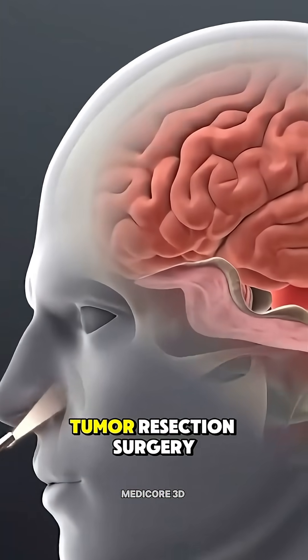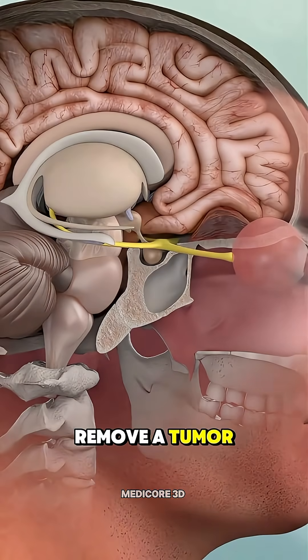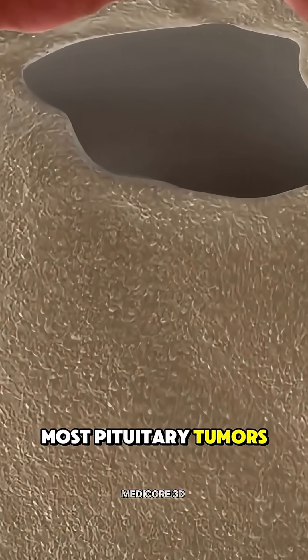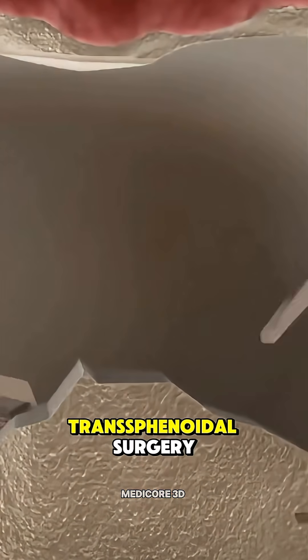Let's talk about how pituitary tumor resection surgery is performed. It's done to remove a tumor from the pituitary gland, which sits at the base of your brain and controls important hormones. Most pituitary tumors are removed using a minimally invasive method called transphenoidal surgery.